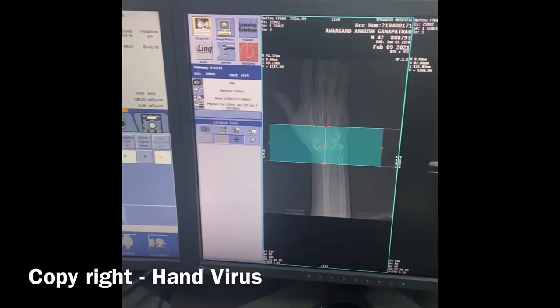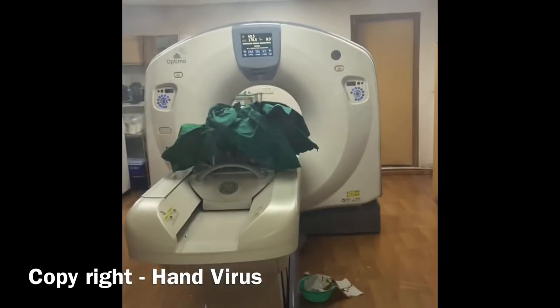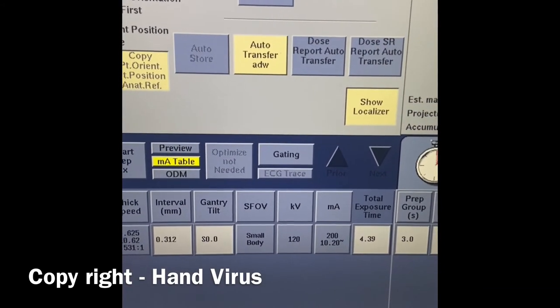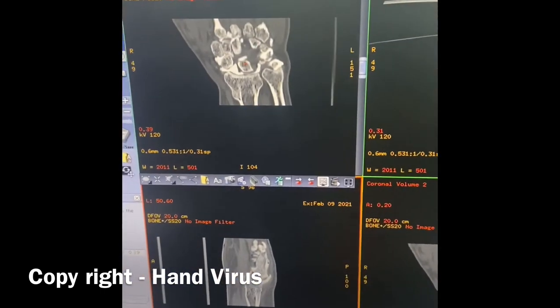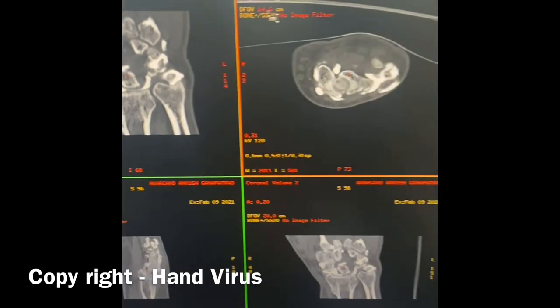This is the scout image we have taken. The patient is in the gantry. The scan parameters are: 120 kV, 200 mA, and slice thickness 0.6 mm. We are taking a sequence and will acquire standard coronal, sagittal, and axial views.